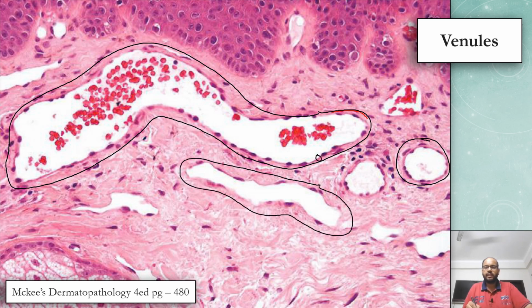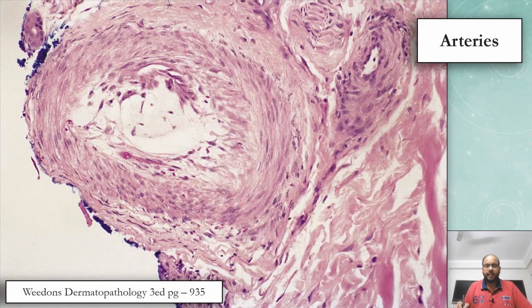You can see the wall that they are singly lined, that means only one cell layer thick. One cell layer thick, isn't it? So these are larger flattened venules. If we see arteries here, it is thick walled. The wall starts from somewhat here.